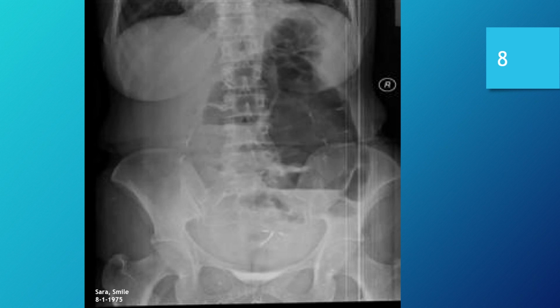So, going from the standpoint of whether or not this is a supine or upright image, I believe that this is an upright image. And the reason I say that is because if you take a look here, you see this very pronounced kind of bowl-like area.